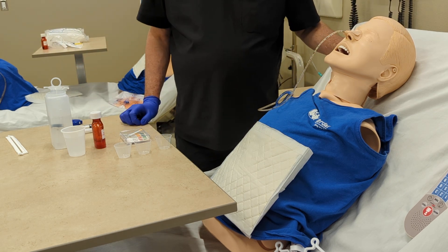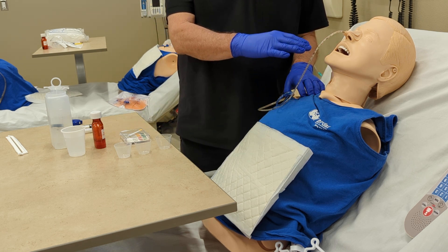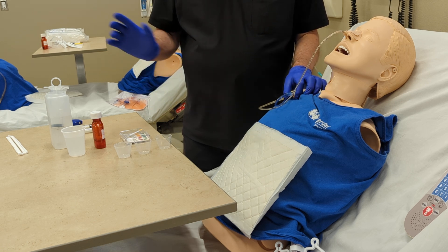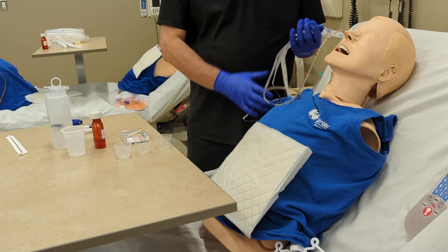Welcome today. We're going to demonstrate giving medications through an NG tube. The previous shift inserted the NG tube and it was verified by x-ray, so we're good with that. But each time we're going to administer medication for the first time, we're going to go ahead and measure ourselves.